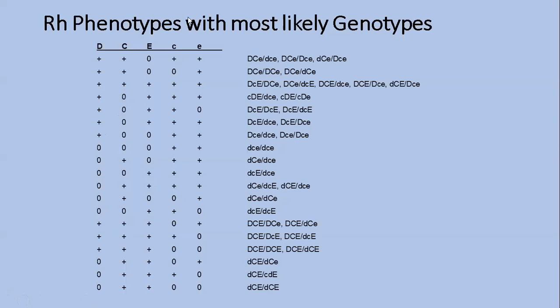let me circle it. Let me do my annotation. Okay. See this one? So if we look at this one, let's see if it checks out. Okay. So big D, big C positive, big E positive, no little c, and they have little e. So this fits the exact same pattern that we got in our testing of our patient.